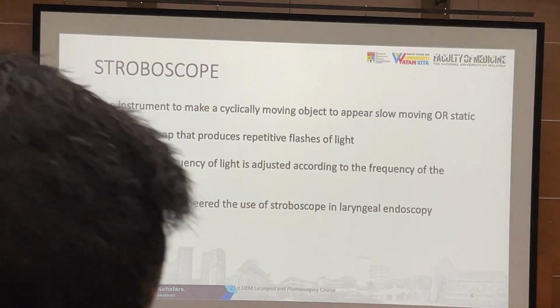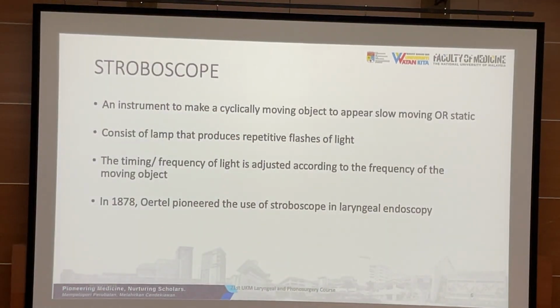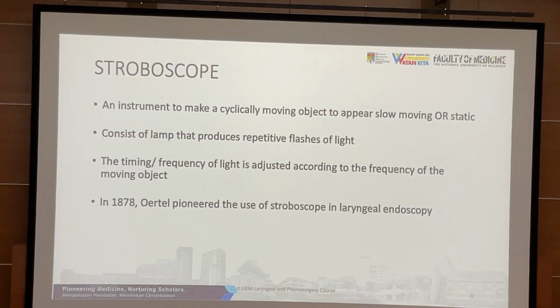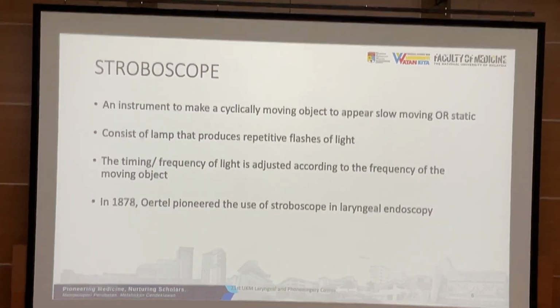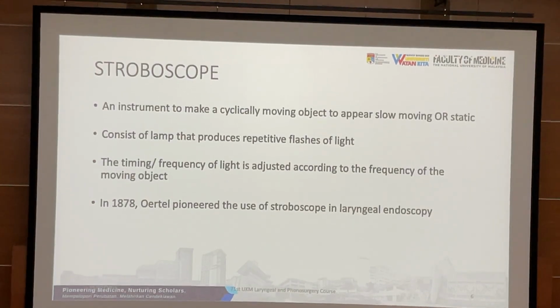Stroboscope is an instrument. Hi, I see Tibun Chin. Tibun Chin has a very nice larynx, and every patient who comes through my clinic, I have to show his larynx to say, oh, this is how the normal larynx looks without muscle tension dysphonia during phonation. Long time no see.